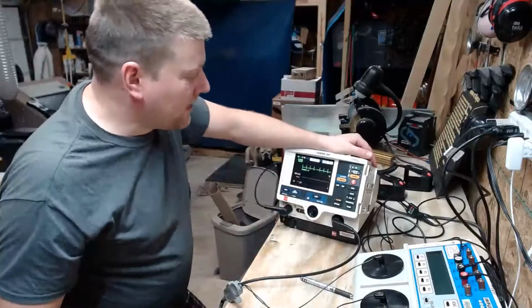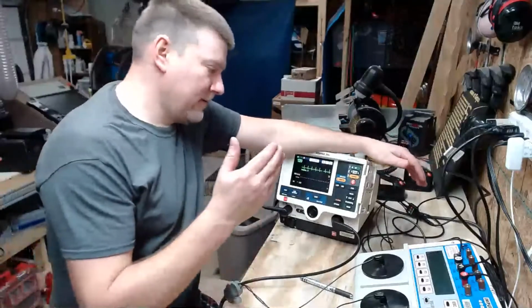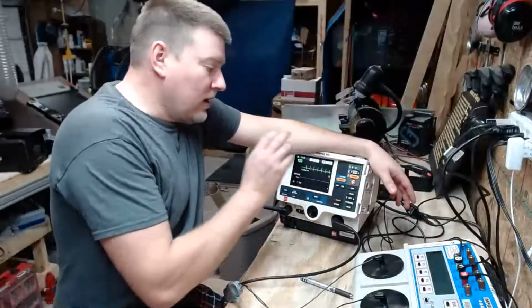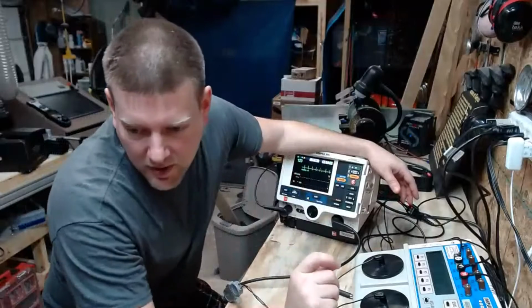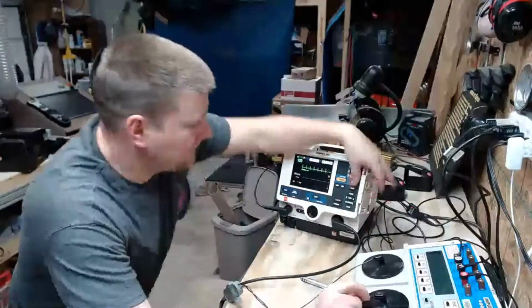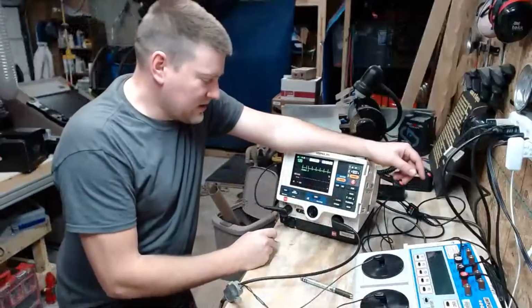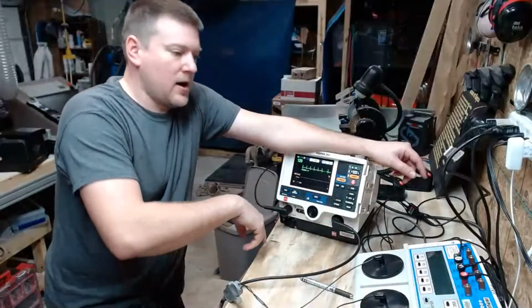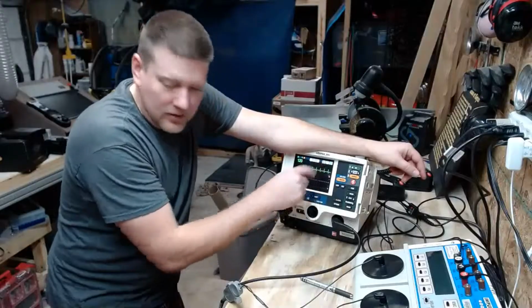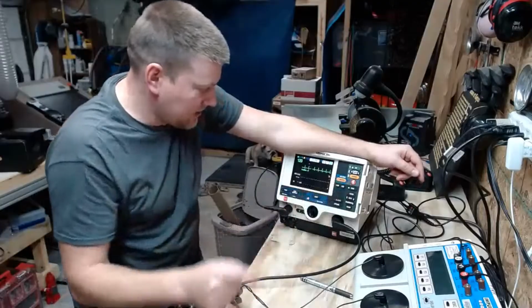Very, very often. So there's a couple of things that I really want to talk with you guys about when it comes to these defibs. Some very important stuff, all right? So these defibs, all modern defibs, do something called cardio sync or sync. You can see the button right here. It says sync. And what that does is it monitors the R of your QRS, that really high point. It's the peak. And it's going to put a dot next to it. You see that?